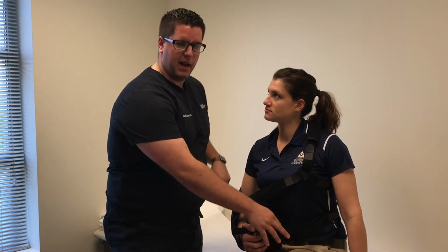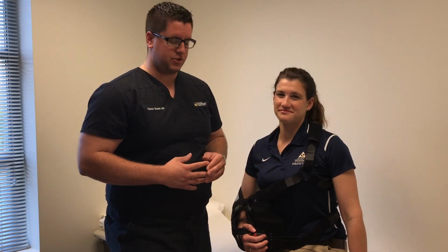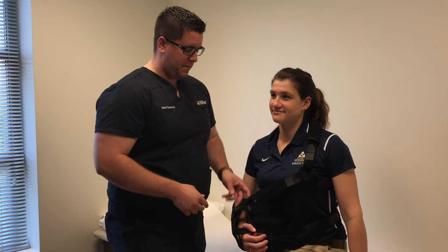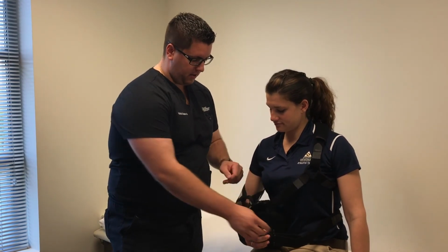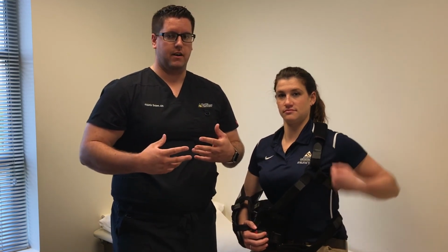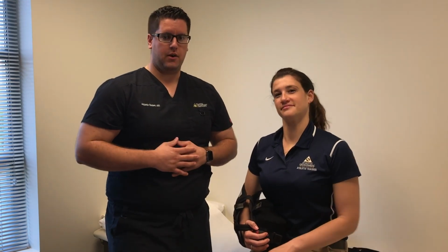And obviously, a lot of play, but just go ahead and tighten that up as shown with the rest of these straps. After that, you are all set to go. And just remember, easiest part is just unclip these and unclip the swath, and you can now take the sling off very easily, just like a backpack, when you're going to the shower and so on.